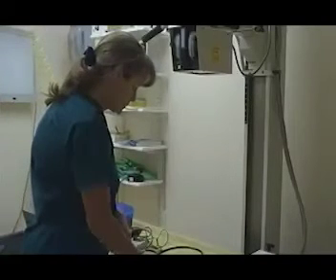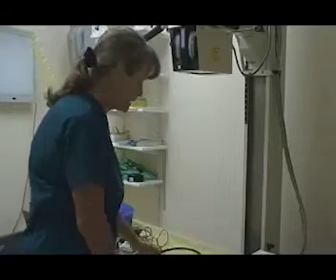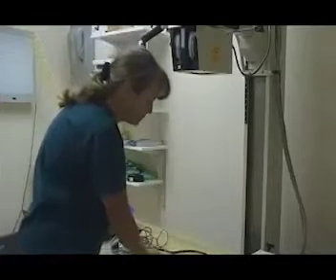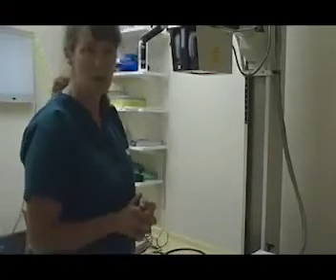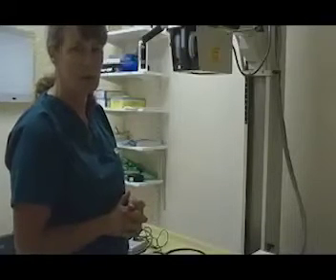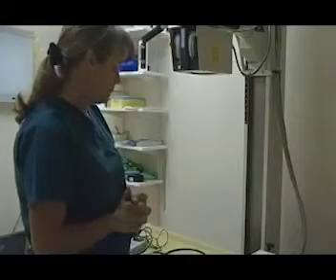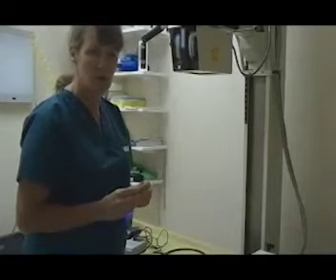Thermometer, of course, to monitor the temperature of the patient to avoid hyper or hypothermia, and the stethoscope to double check, again, the heart rate, and you can also listen for respiratory sounds, any crackling or wheezing, stridor, or things such as that. One other piece of equipment that I don't have here with me is the ECG. It's a pretty big piece of equipment that we have in surgery.